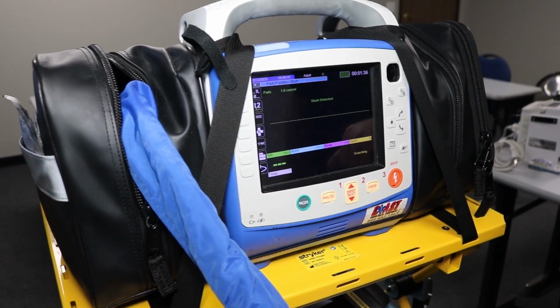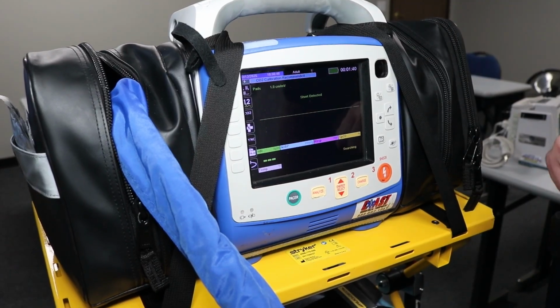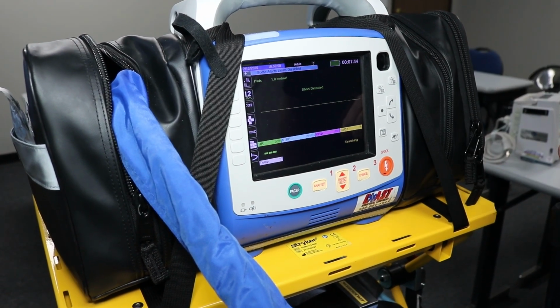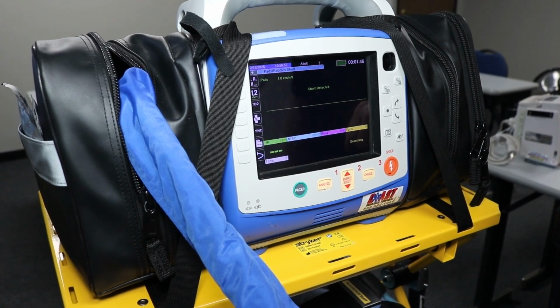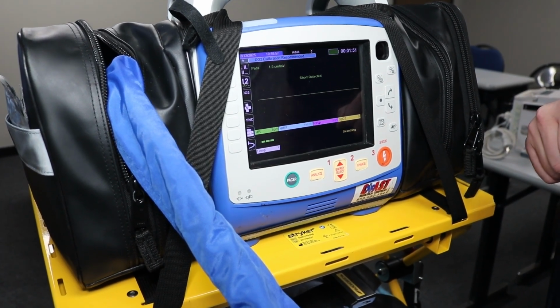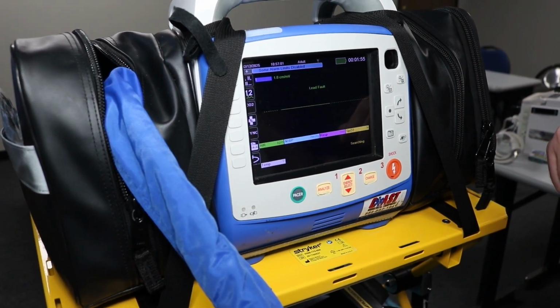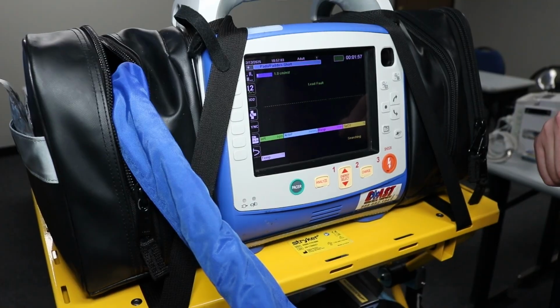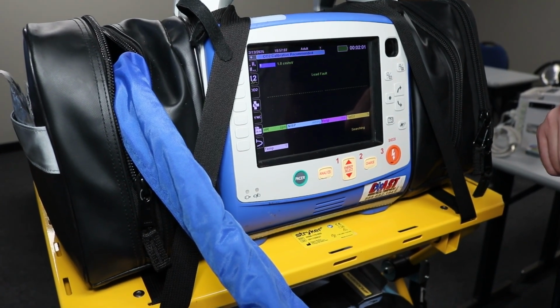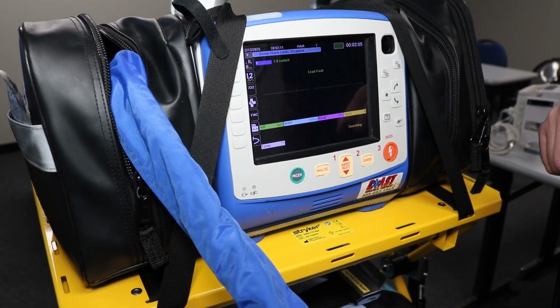If we have our leads hooked up and we're still not seeing any leads here, we make sure we know what setting our leads are at. Right now it's set to pads. If you need to switch it to a different lead, like lead 2 or 3, whichever lead your nurse would like, the very top button here will cycle you through different leads. Most nurses like to monitor in lead 2, but it's up to your nurse's discretion. Make sure you know which one they like to utilize.